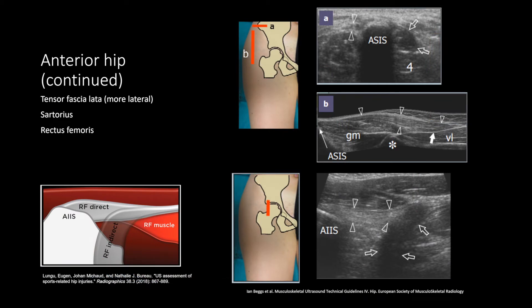For evaluation of the TFL and the sartorius, place the transducer in short axis at the anterior superior iliac spine. In the top right image, you can see the TFL muscle on the lateral side, denoted by the void arrowheads, and the sartorius muscle on the medial side, denoted by the void arrows. When evaluating the rectus femoris, the transducer should be over the anterior inferior iliac spine to look at the direct tendinous attachment. The hypoechoic region shown by the void arrows is the indirect tendon with anisotropy artifact joining the direct tendon.